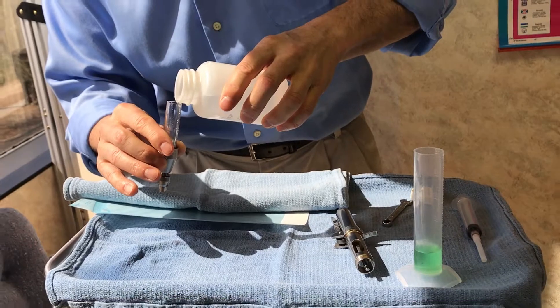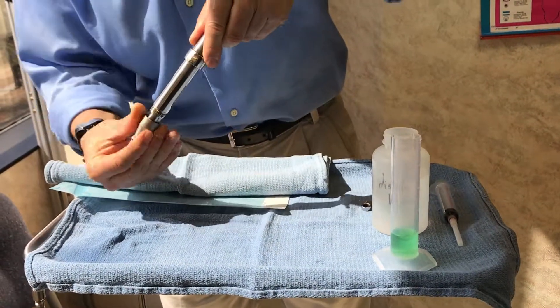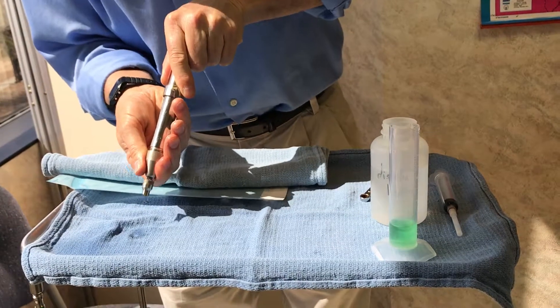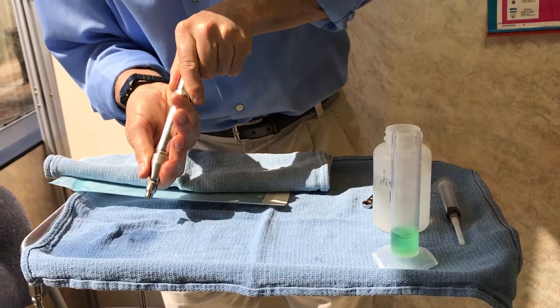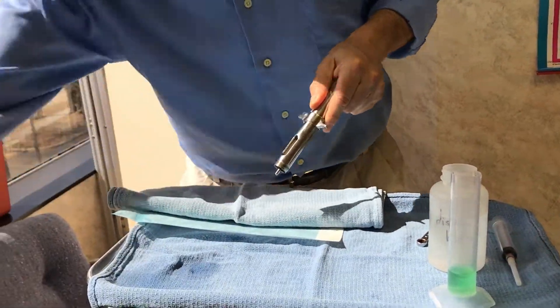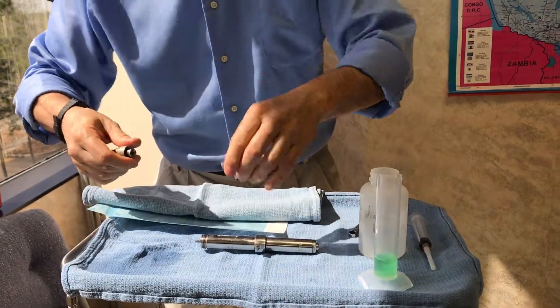So I'm rinsing it with a little bit of distilled water by what we call priming it — we're essentially rinsing that head out. When I'm done I can pour out the water and now disassemble the MetaJet.